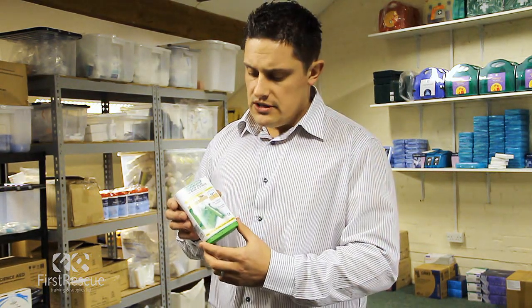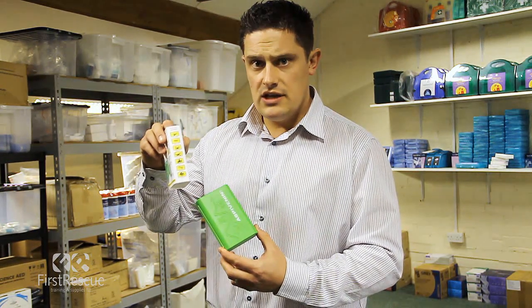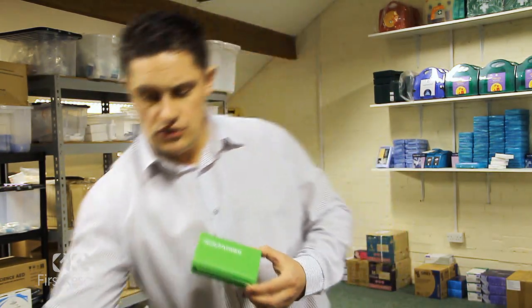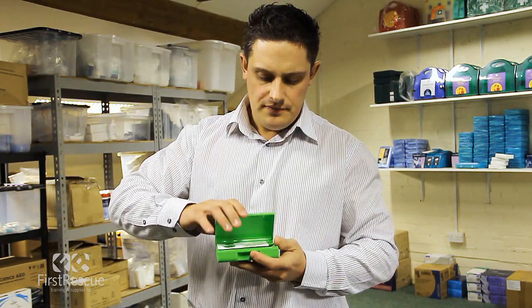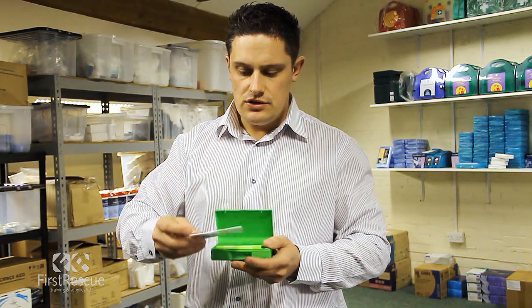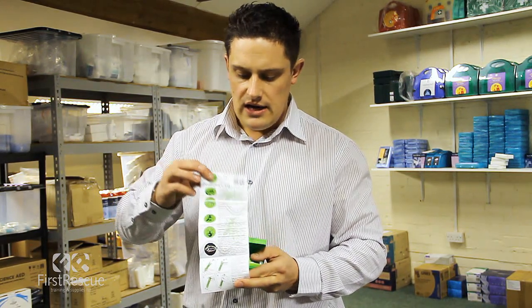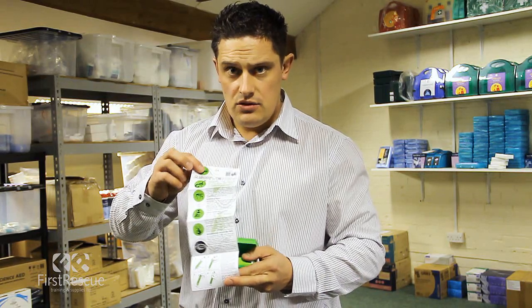We take the product out of the sleeve — there is some information on the sleeve as well as to what it can be used on. We open the box and inside we find the actual instructions for use, which give information on how to use the product and what it can be used on.